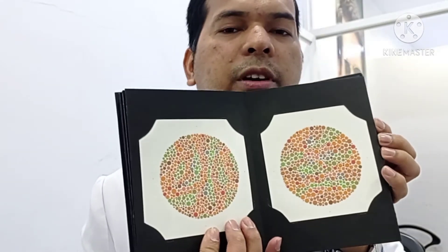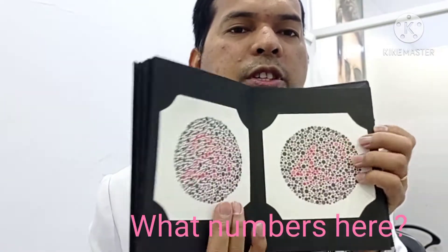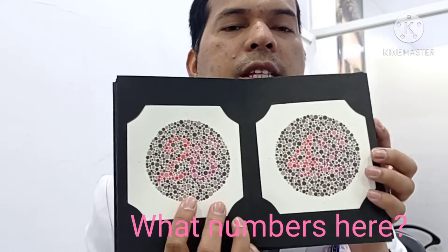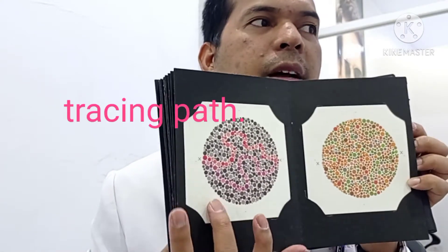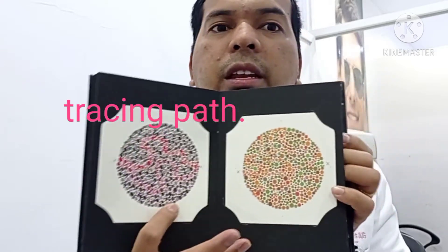Do you see any number? Are you seeing numbers here? No — because you are having normal vision. What number is this? 26 and 42. This one — a winding path. So trace this one from here — any winding path.